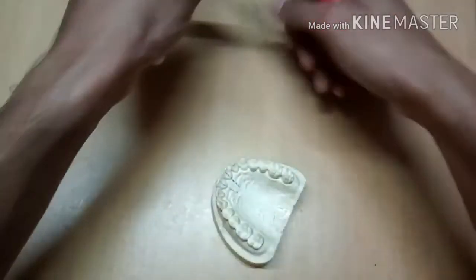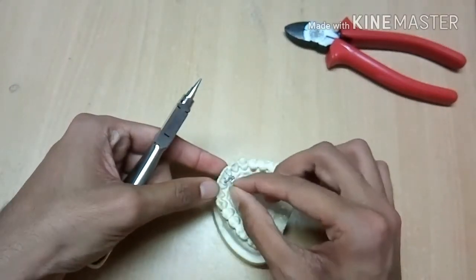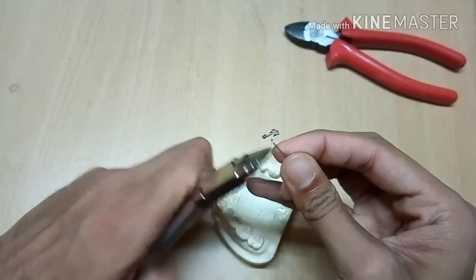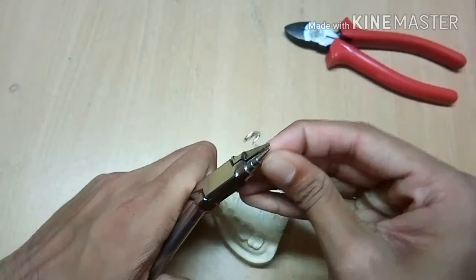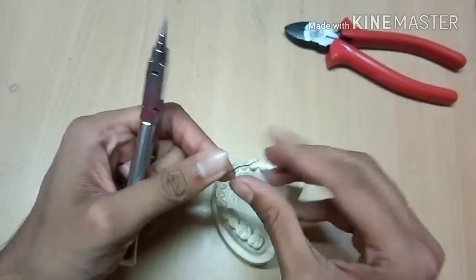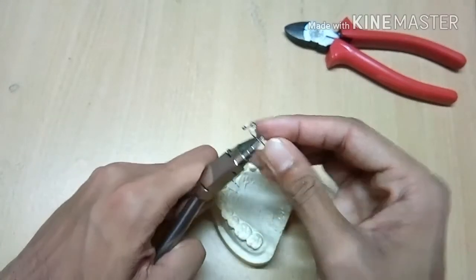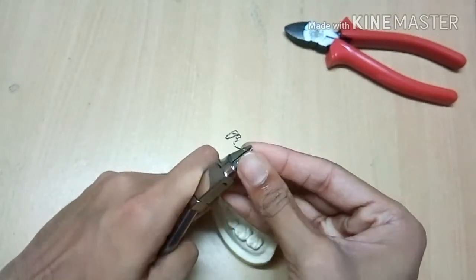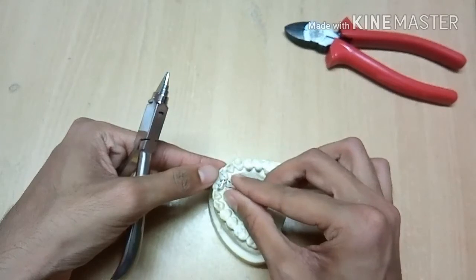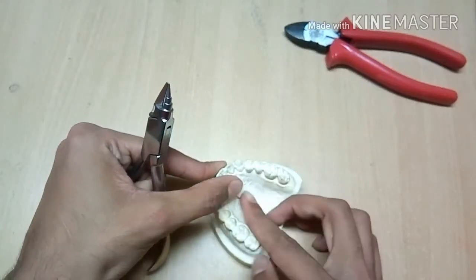Now adapt this on the palatal surface. Also make sure that the retentive arm does not go to the opposite side of the midline.